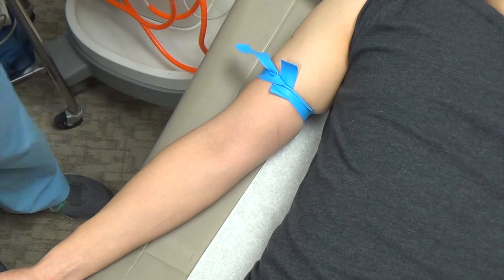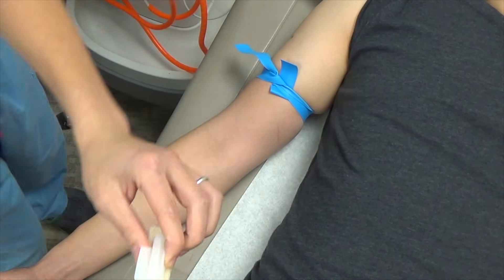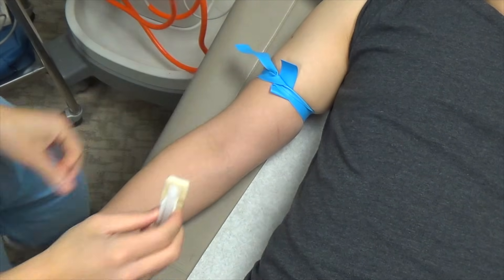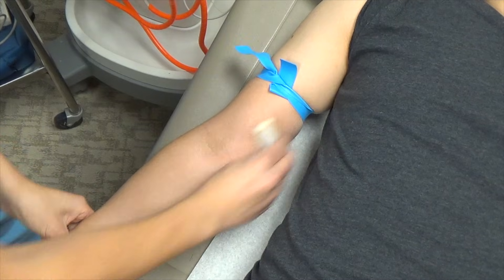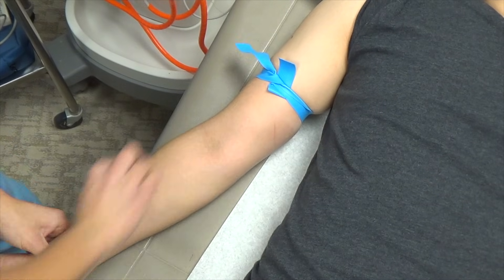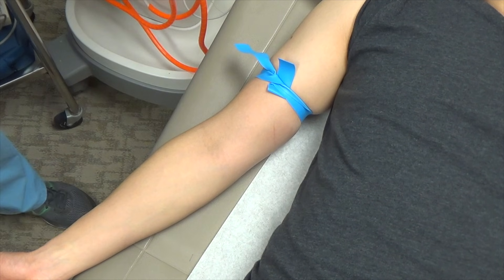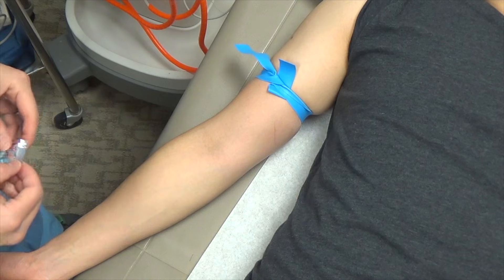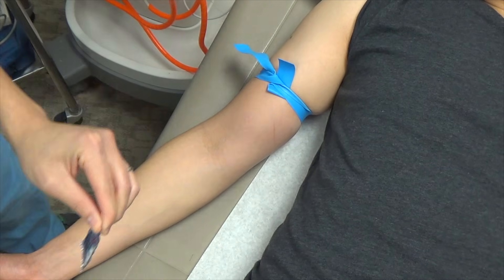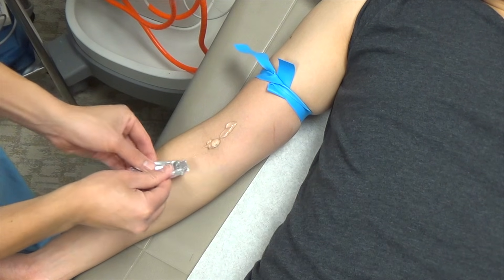After placing the tourniquet, use a chloroprep — break the seal and, with gloves on, prep the entire forearm. The reason for prepping the entire forearm is that you'll be looking not just for the deep brachial vein, but also for the cephalic and basilic veins. After the chloroprep, get some sterile jelly, open it up, and place it along the antecubital fossa and a little bit lower as well.